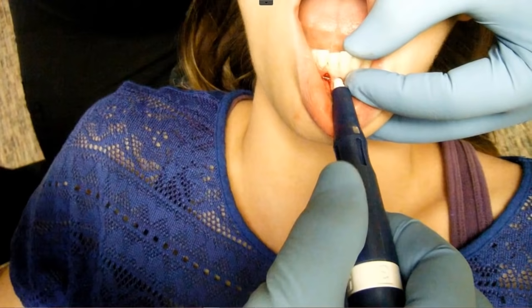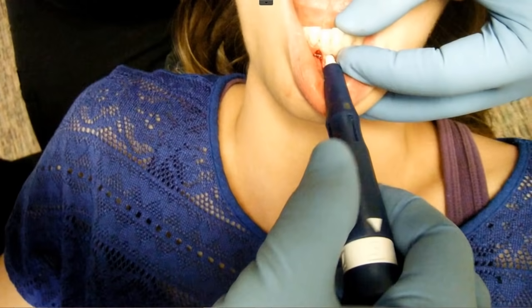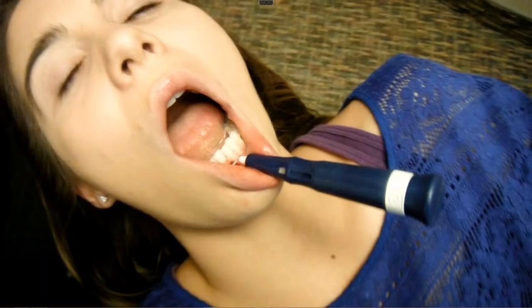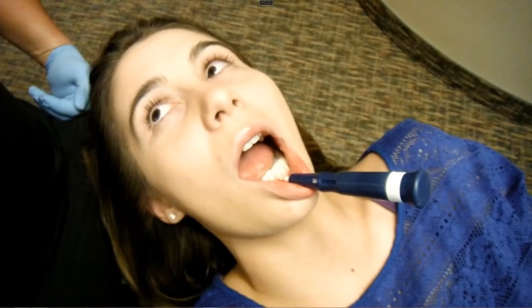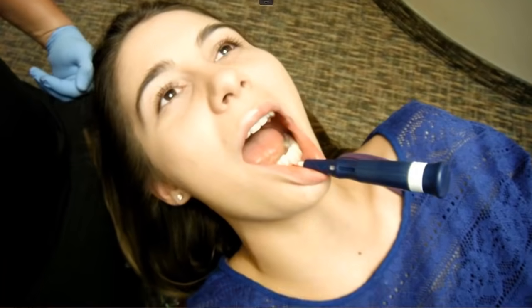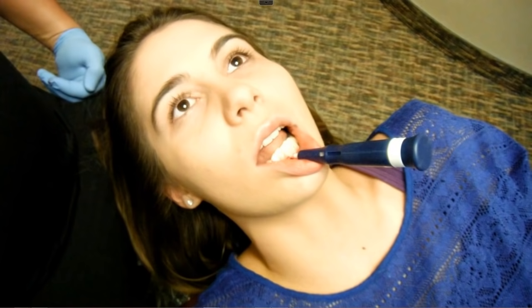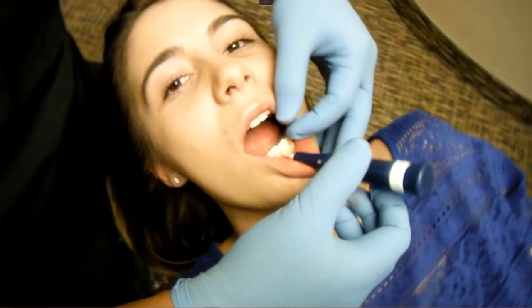So this is me doing Propel on the patient. Unfortunately, I don't have good audio on this, so I'll have to tell you. I asked her, "Hey Becca, how you feeling?" She says, "I feel fine, no pressure." Yep, just a little bit of pressure, but I'm not hurting at all. It's fine. So this is 2 to 3 millimeters in the bone, and she's feeling just fine.